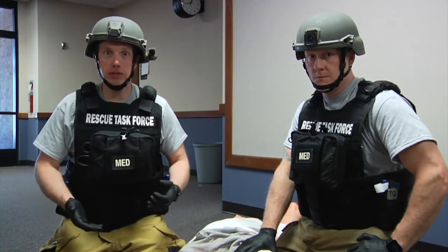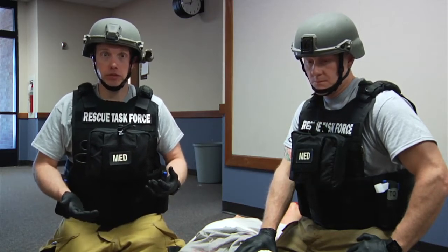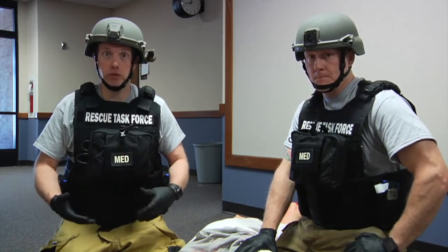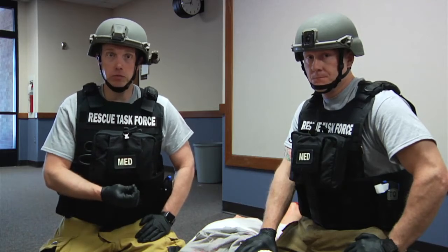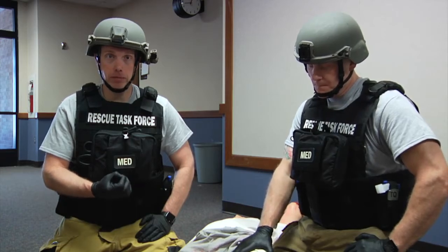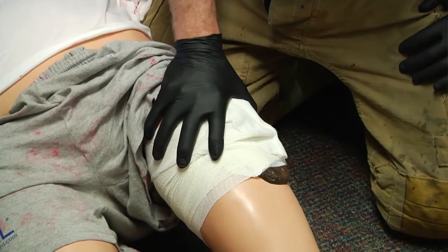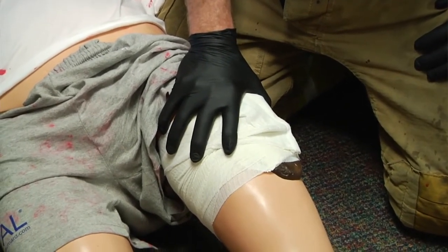Today we talked about bleeding control in areas where we cannot place a tourniquet. These are junctional areas — where something joins our pelvis or our thorax, so where our legs join the pelvis or where our arms or neck join the thorax. These are areas where we cannot apply tourniquets, so we need to utilize wound packing. We firmly packed gauze into the wound to back up the mechanical pressure applied with our fingers, held direct pressure outside of that wound for three to five minutes, and backed it up with a pressure dressing over top of it.